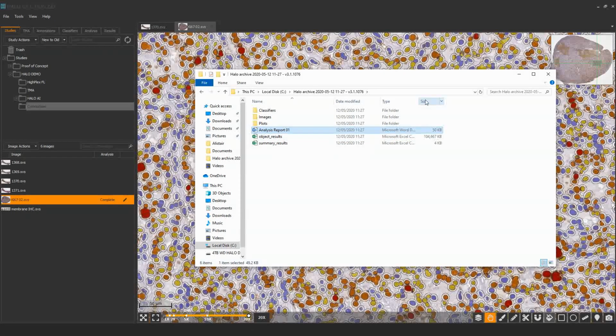I know Alistair sent some images through, which we're able to deep dive into and pick apart the approach for that particular image. But I'll open it up to Marie Renner just to see what she would like to do at the end of the allocated time.